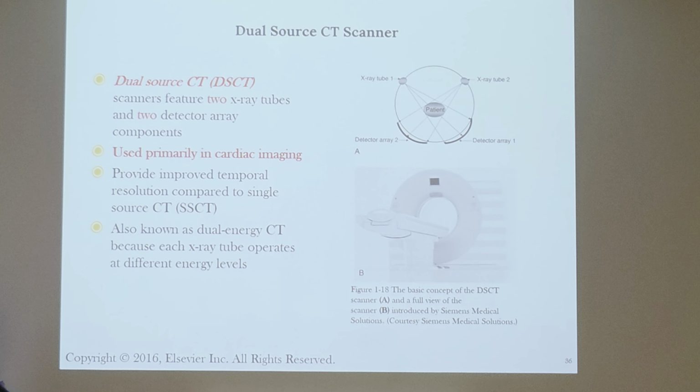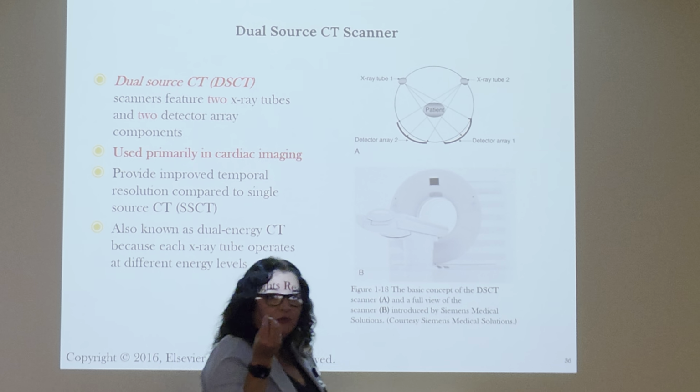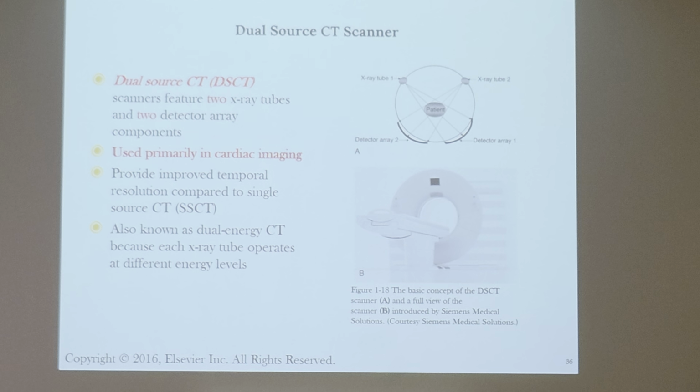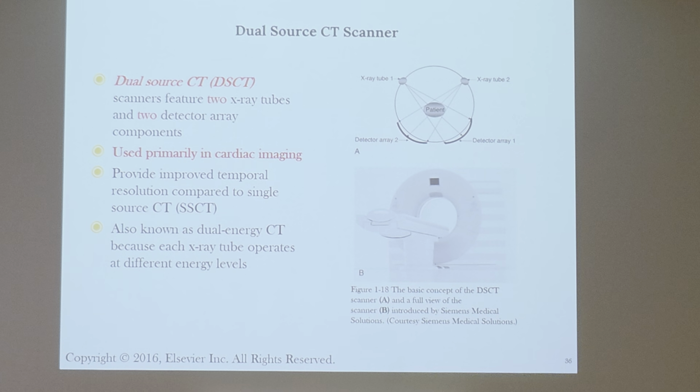Okay, spatial resolution is the accuracy with which you can depict anatomy. When something has very high spatial resolution, it has clarity. You can see. We call that efficacy. When you have a diagnostic efficacy type image, it means that the radiologist in theory has the ability to determine what is wrong with the patient. If the image is blurry, then you reduce the efficacy, or the ability to diagnose issues.